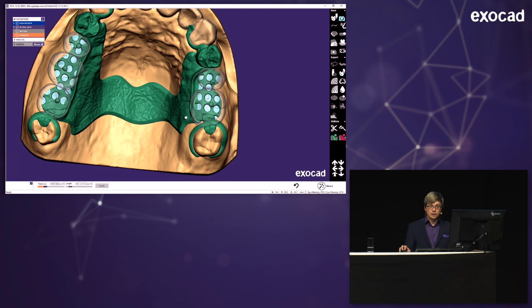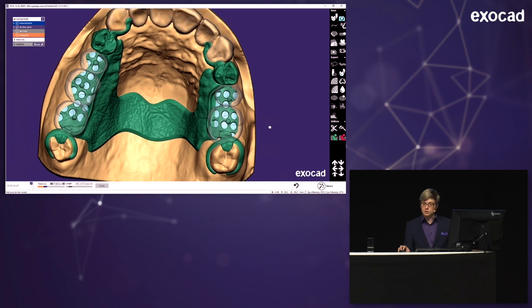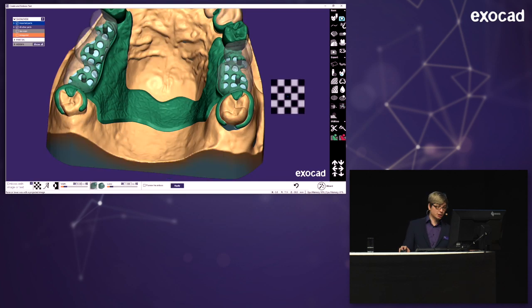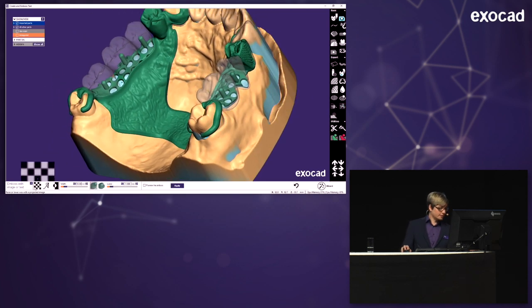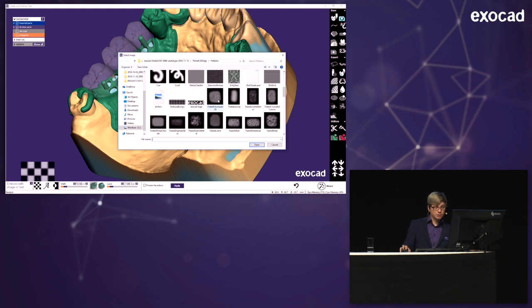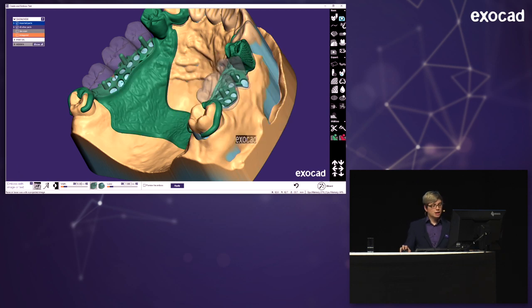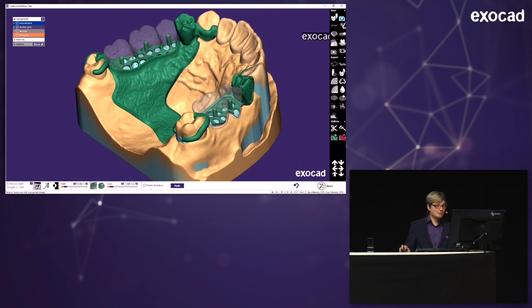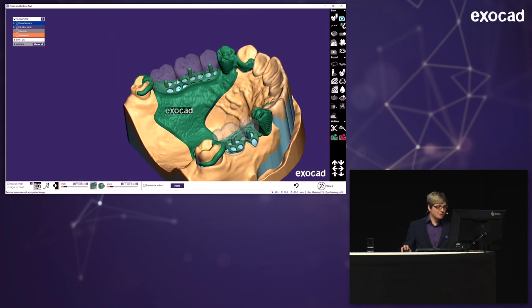Okay, another option you have. Does the time say? No. I'm showing you one other thing. Another option you have is to add text and pictures. And here you can choose several pictures, like a random logo from a random company, I don't know. Maybe your company, maybe mine, whatever pleases you. You could actually add the name of the patient there, because if you lose a partial framework and there's a name on it, it's way easier to find it.